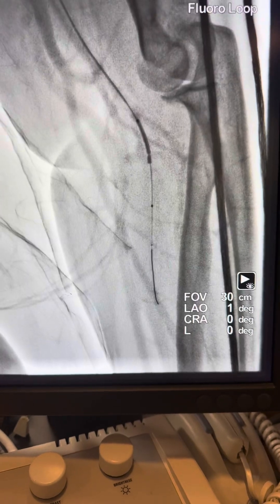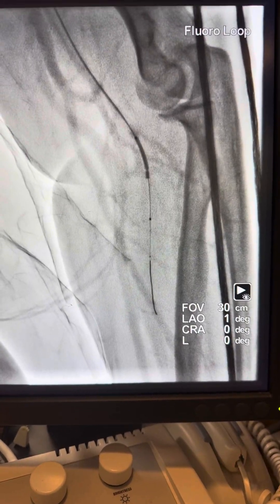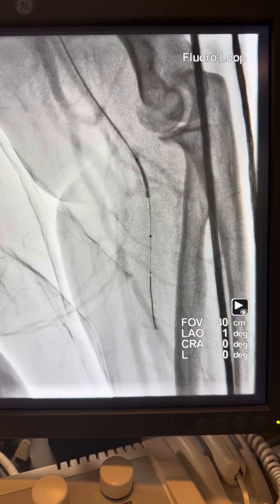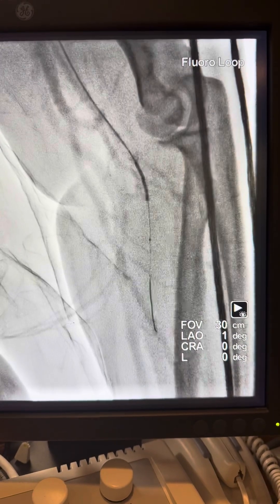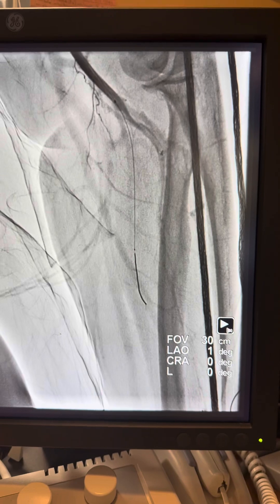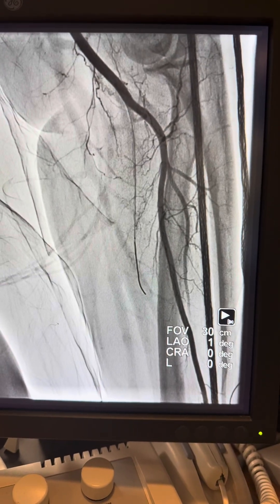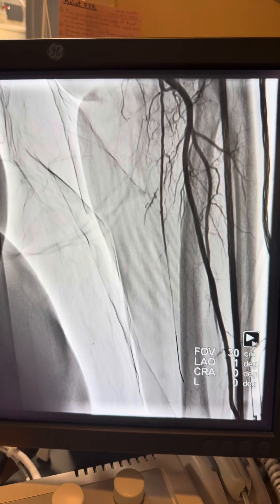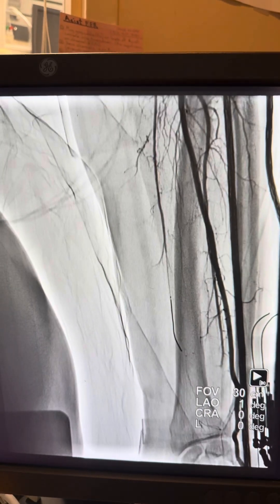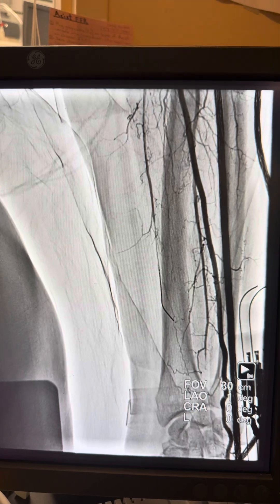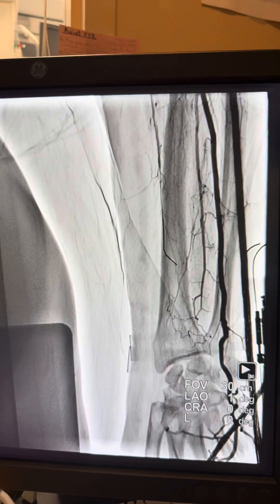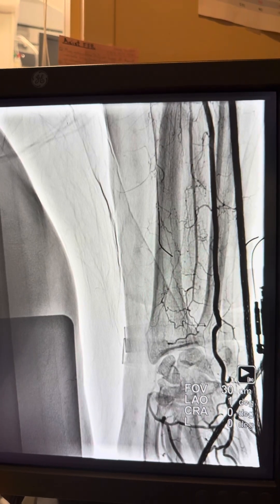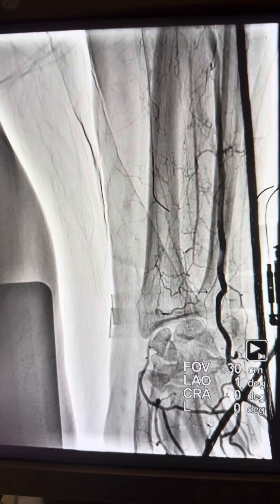The run-through wire did not pass distally. We inflated the balloon proximal to the occlusion to see if we could improve flow distally and visualize the true lumen — still no flow distally. With more ballooning in the proximal and mid segment, flow was slightly improved, but the wire still did not cross into the true lumen.